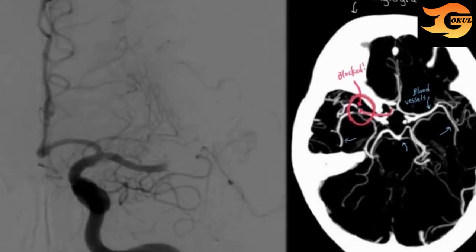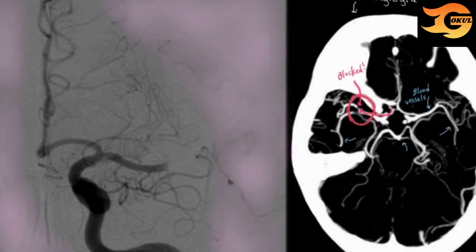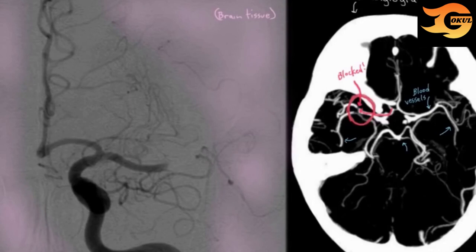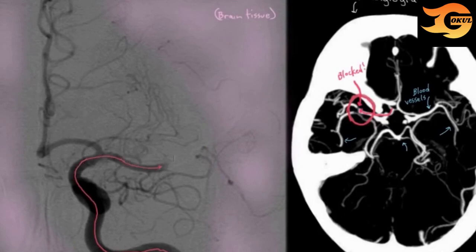In another type of angiography, computer software hides the image of the actual brain tissue and surrounding structures — your skull, meninges, etc. — so what you're left with is just the cerebral blood vessels. You can see everything that is not a blood vessel has been hidden, and this image gives a pretty clear idea of what caused the stroke. Everything looks good — until sudden stop here: there's a blockage. Blood's not going through, and that's a problem for the tissue on the other side.